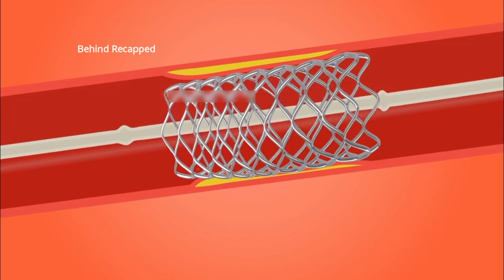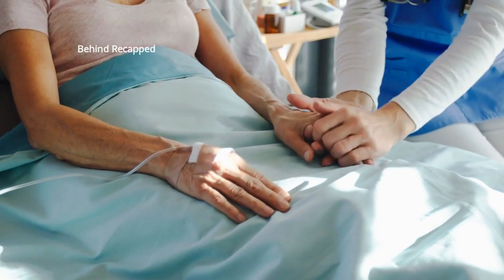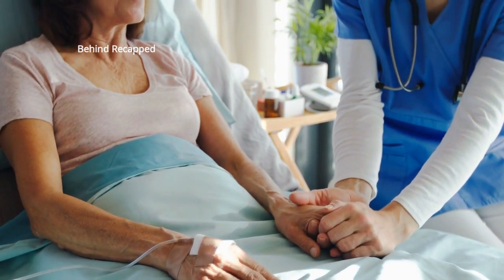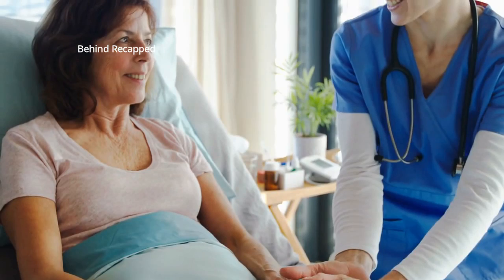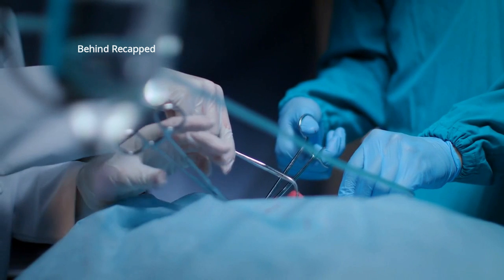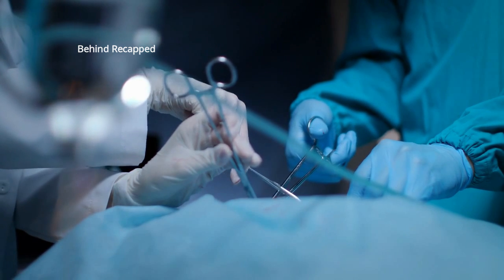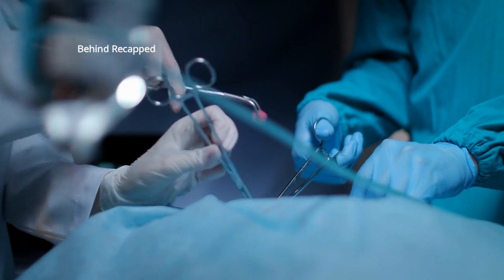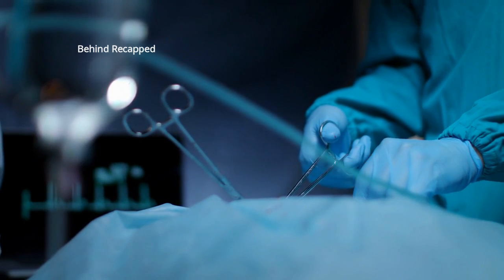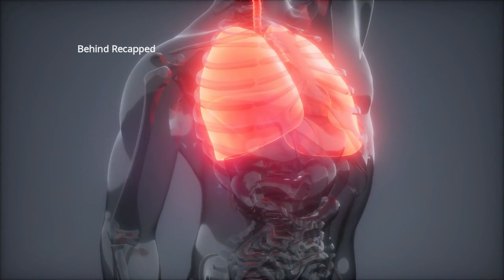Most stents implanted during an angioplasty are drug coated. The medicine in the stent is slowly released to help prevent future plaque buildup and the re-narrowing of the blood vessel. Recovery: when angioplasty is completed, the cardiologist removes the catheters and applies bandages. Usually, a person will recover in the hospital for a few hours or overnight before going home. People can often return to work within a week. However, their doctor will advise on how active they can be.